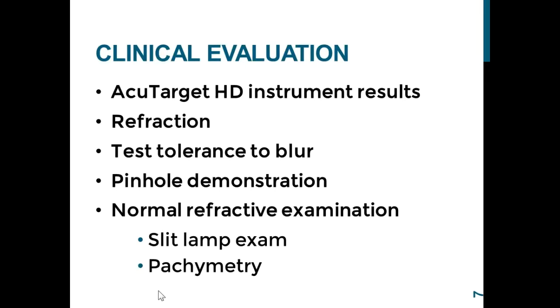Now, are you using pinhole, Sandra, with trial frame or just loose lenses or behind the phoropter? I use it with, we actually have that, I don't even know what it's called, that little occluder that we can open and close with the multiple pinholes. Right, Larnette. Yeah, so that's what I'll use for the patients. What do you use?